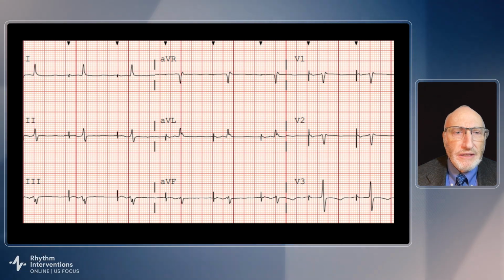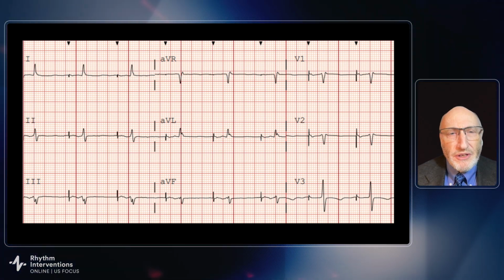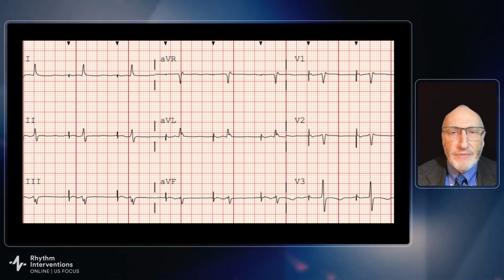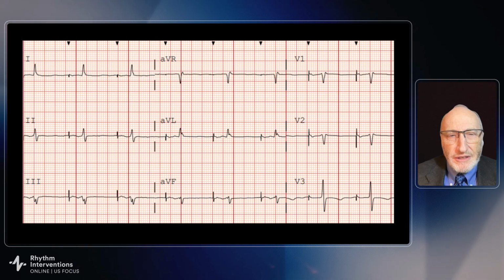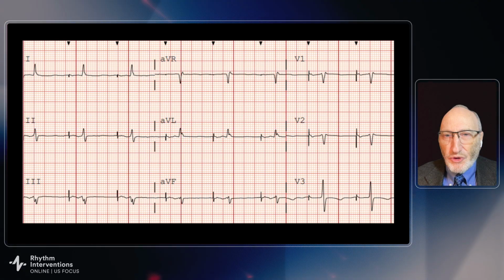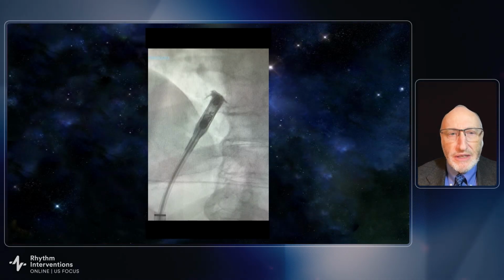Nonetheless, if you look at the P wave, it's probably about sinus rhythm, which I still think is quite a bit better than around the appendage, where you see a quite large P-wave duration. The Vermont group has looked at various positions within the septum, and clearly the achievement of the morphology at Bachmann's bundle is important in the suppression of arrhythmias.